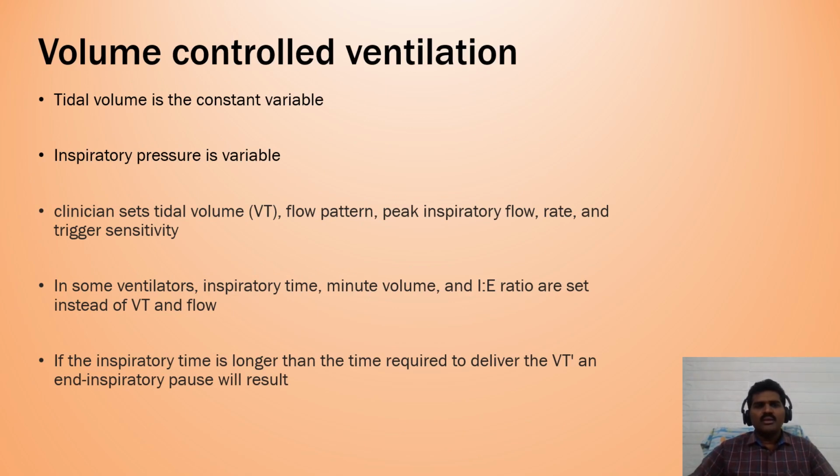There are mainly two important modalities of mechanical ventilation used. One is the volume controlled ventilation, the other is the pressure controlled ventilation. In volume controlled ventilation, tidal volume is the constant variable. Inspiratory pressure is usually variable.